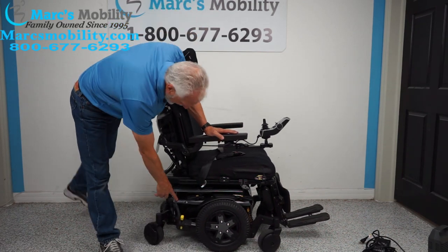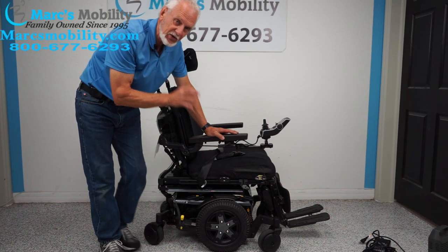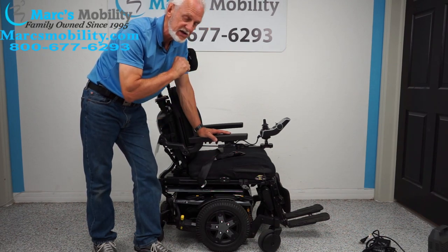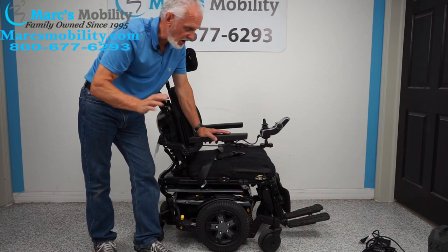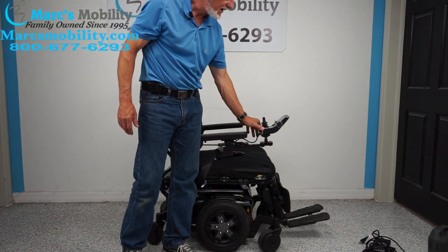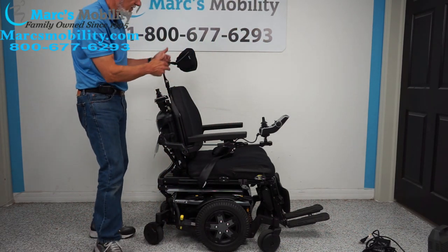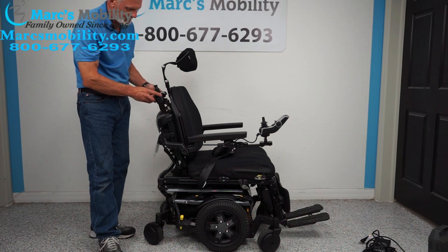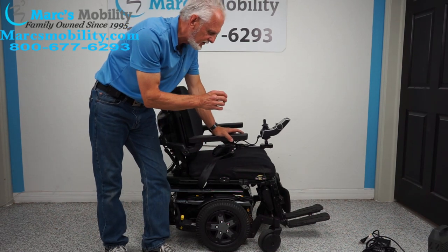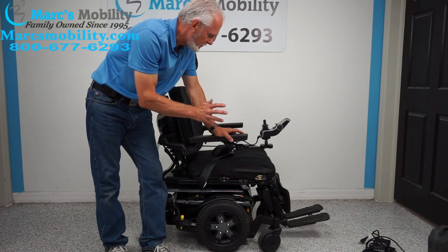Let's recap. This is the Quantum Edge 3 power chair from Pride Mobility — a high-end chair from their Quantum department with 8 miles on it, practically brand new. It has the 12-inch seat lift, electric tilt, electric recline, electric feet, flip-up arm, swing-away joystick — and if you're left-handed, we can put everything on the left side. You also have the safety belt, custom headrest, attendant control, solid tires, anchor points, and the suspension we talked about. This is truly a really nice high-end power chair.